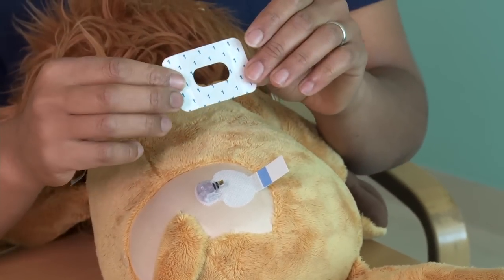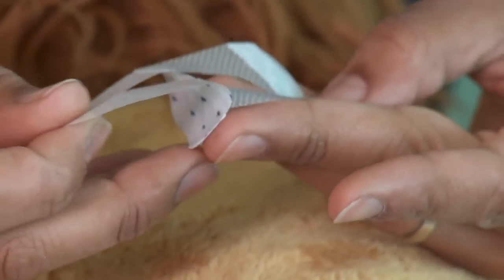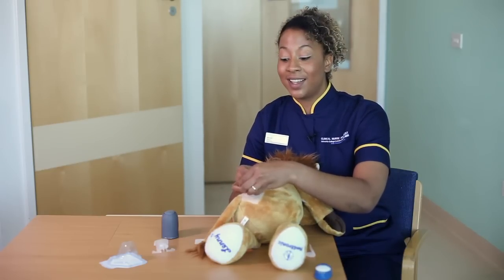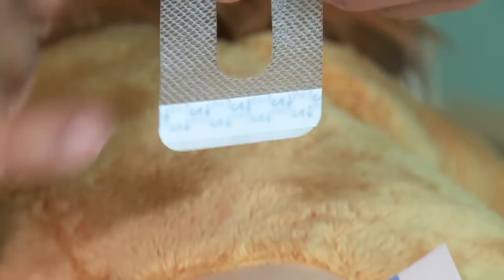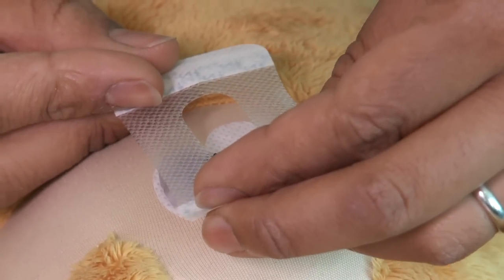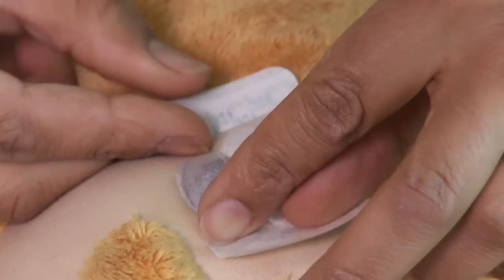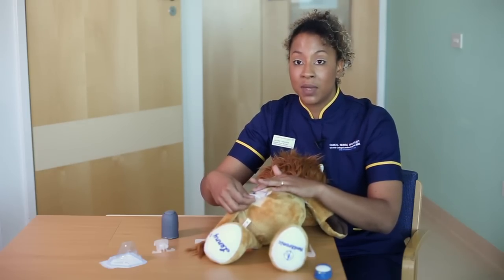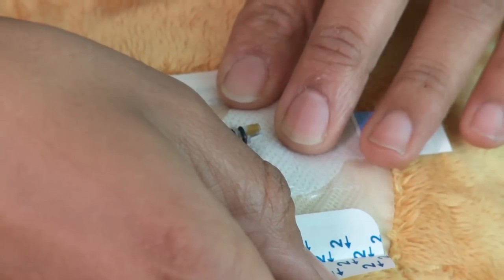The dressing tells you clearly which part to take off first — peel off number one. It's tempting to place the dressing right over the top so the sensor comes through the hole, but you really need the dressing to be firmly holding the sensor down in place. Give it a little stretch and place it right over the top of the sensor, stretching it down as you go. It's really important it's stuck in well, as this determines the sensor lasts the full seven days. Then pull away the side tabs marked number two.